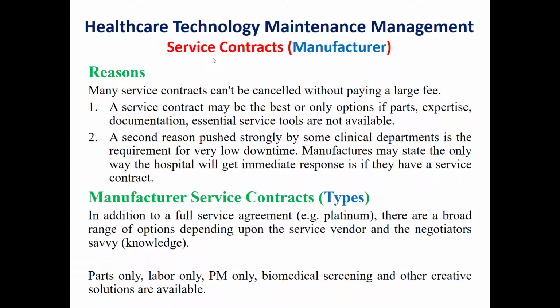The reason to sign such type of contracts will be, for example, that this type of contract will be the best or the only option if parts, expertise, documentation, and essential service tools are not available.